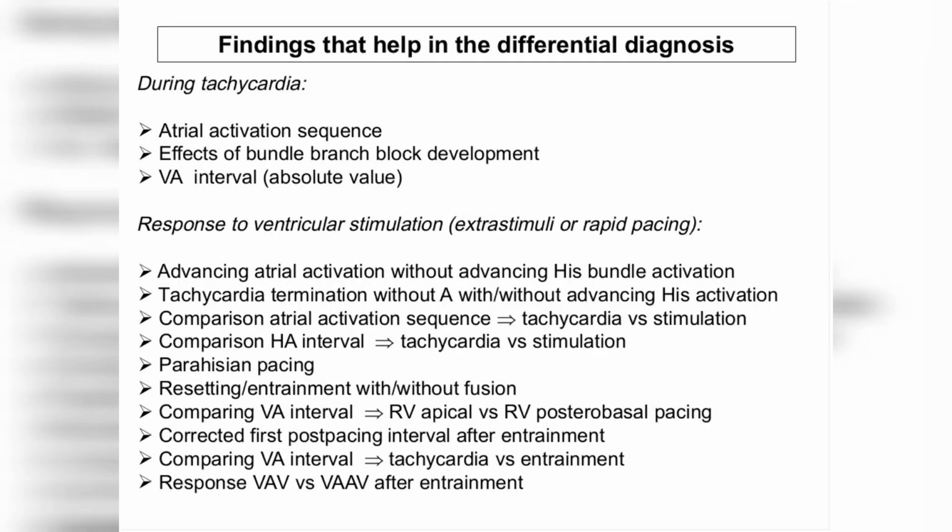In this slide, I show you a number of things that we can do, and this is only part of what has been described over the years. Let me remind you that this is an old issue. We have been talking about this for more than 20 years now, but still it's interesting that every single year there is some new maneuver that is described. So this is still an active research area.